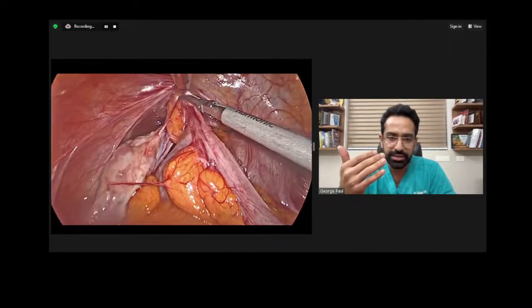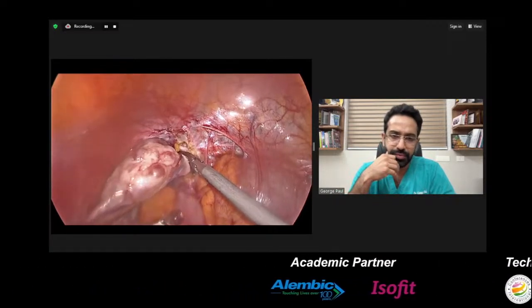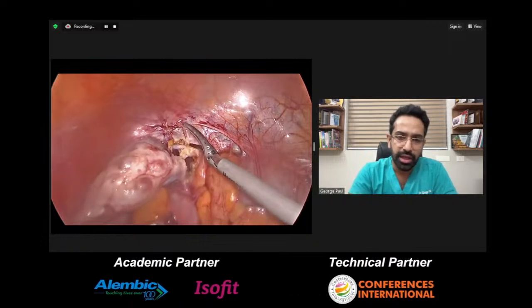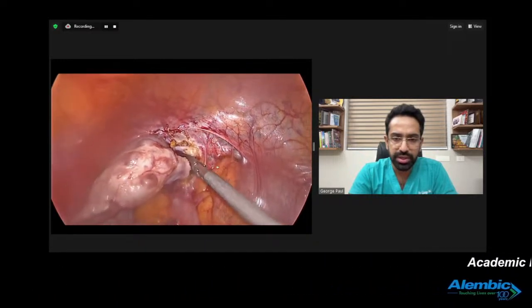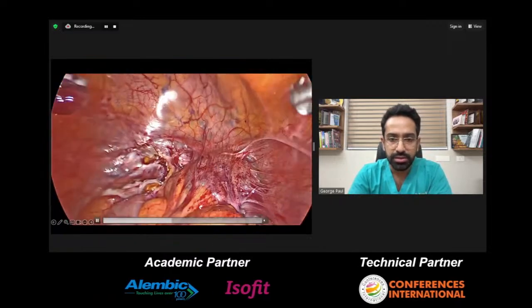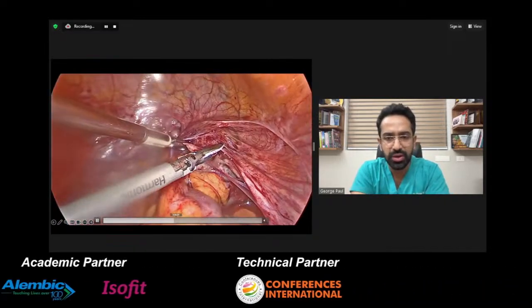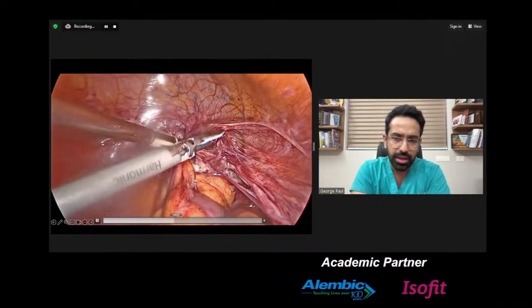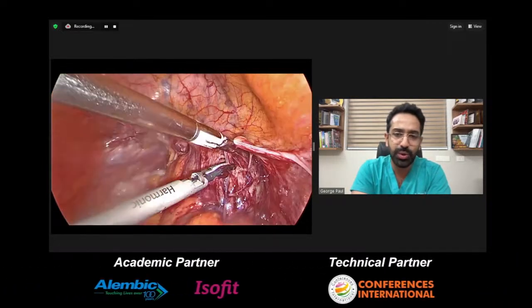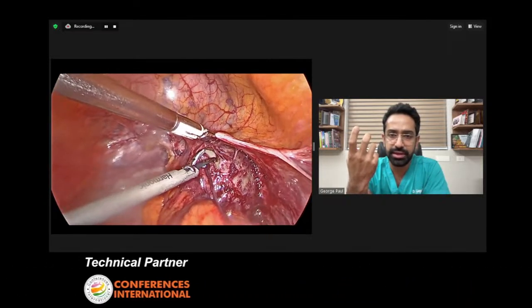So we were releasing all the small adhesions from the vault, and we were releasing the ovary as well from there. And according to the MRI, there was a mass on this side. You can see here. So this was a globular parasitic myoma. We were releasing all the flimsy adhesions. You might have a tendency to underestimate the vascularity these masses take in.